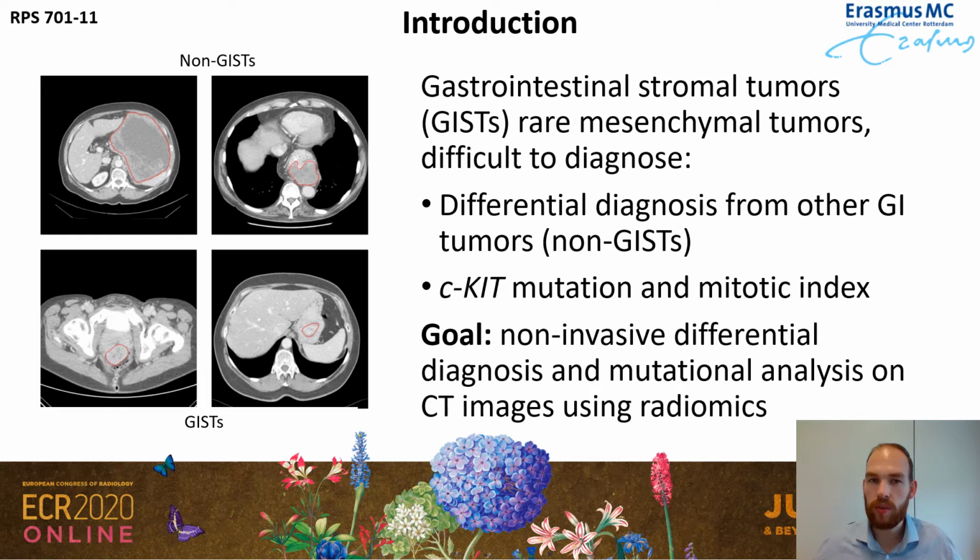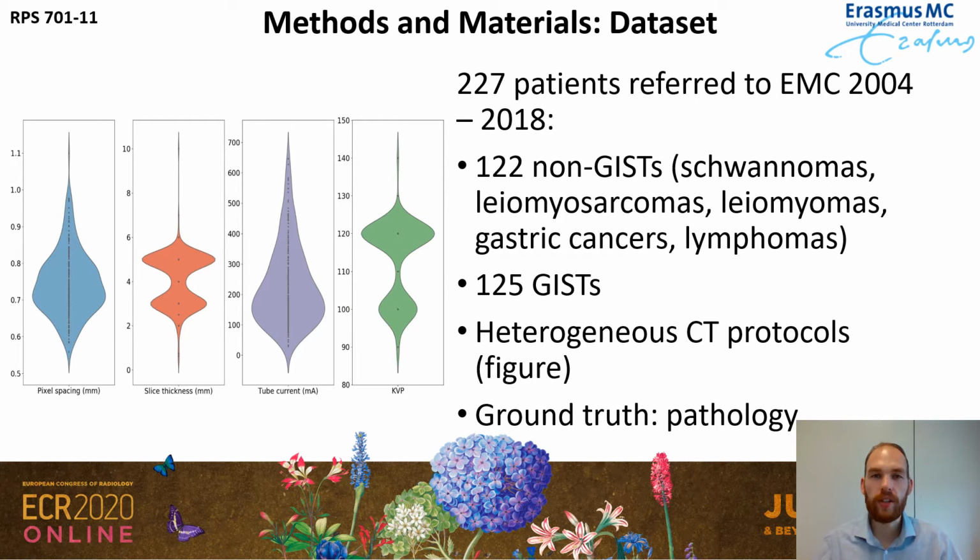However, this diagnosis is quite difficult to do in imaging, so therefore currently an invasive biopsy is used. Therefore the goal of the study is to find a non-invasive alternative based on CT using radiomics. So let's first take a look at the dataset that we're using.